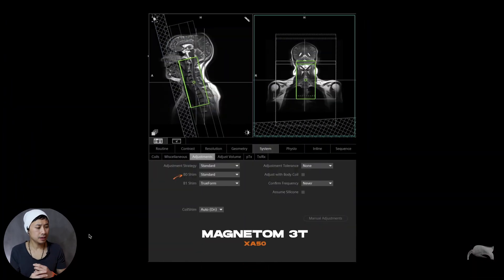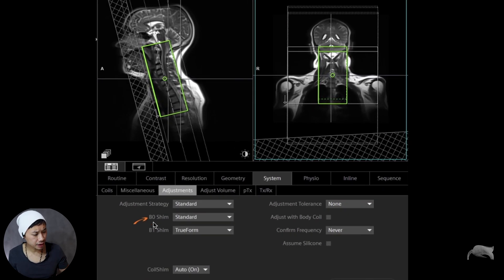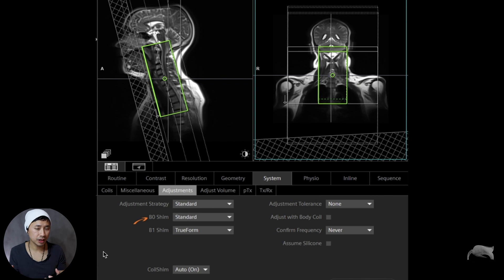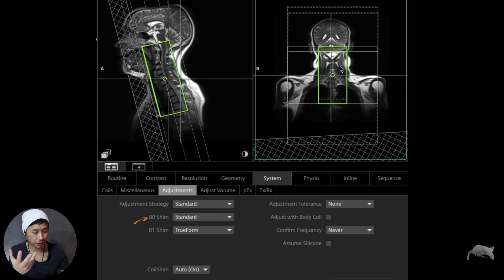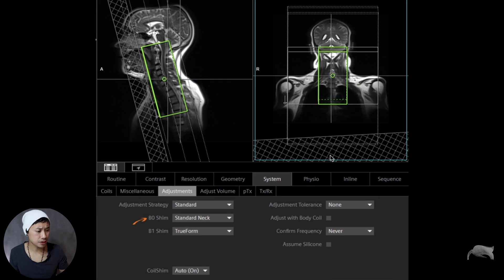We're currently at 3T and we're using the XA50 platform. As you can see I already marked our B0 shim, so that gives you a clue of what we did — yes, it's shimming. What did we do when it comes to shimming? We tried first the standard mode and activated the visualization of the B0 shim box, so you can see where it's placed automatically — it's placed on the neck area where we're doing the coronal T1 SPACE. Our next test was changing that to Standard Neck. As you can see, it's almost the same but we're now using the B0 Standard Neck mode.